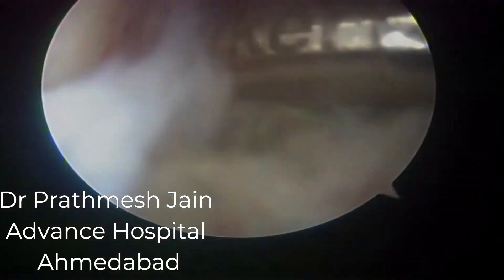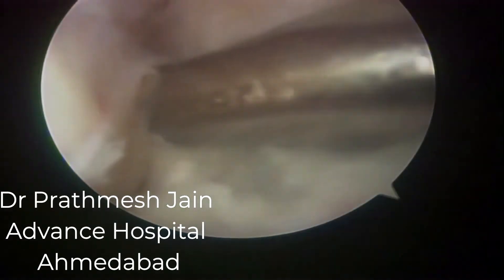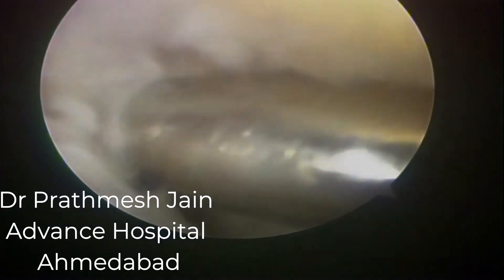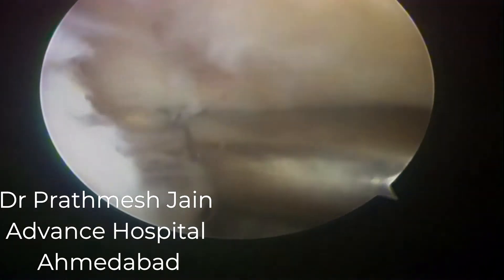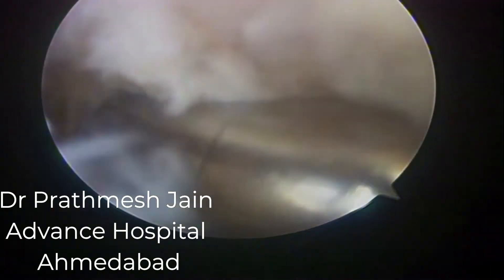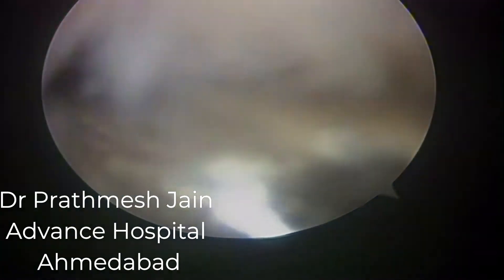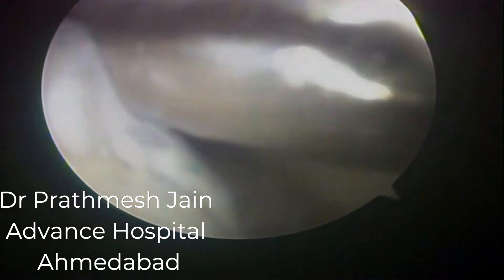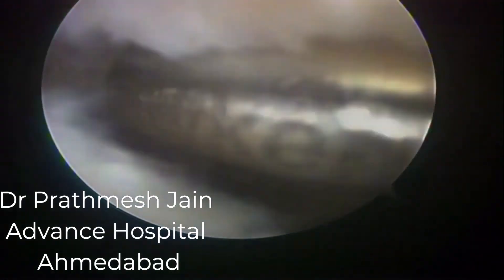This lateral tissue is very thick in this particular patient. We then proceed to release the parapatellar gutters on the medial as well as lateral side. When we release the thick lateral retinaculum — both the medial patellar retinaculum and the lateral patellar retinaculum — the mobility of the patella increases significantly, and our mobility inside the knee joint also increases a lot. As we release these tight bands the patella becomes more mobile.